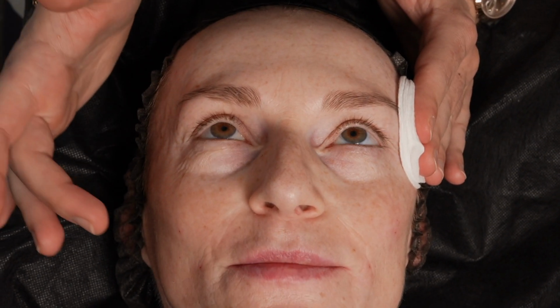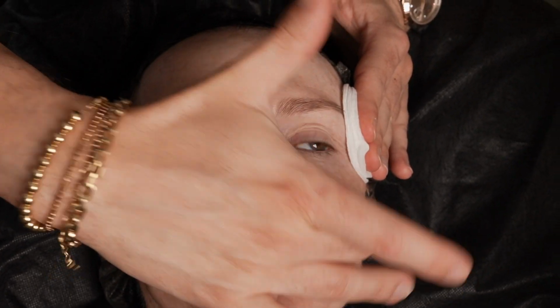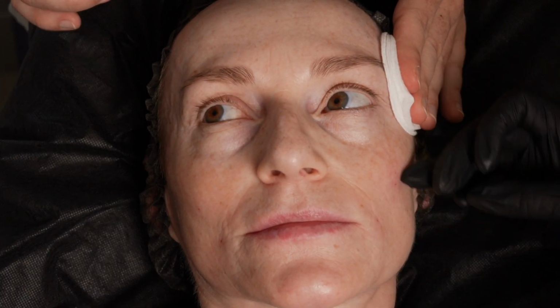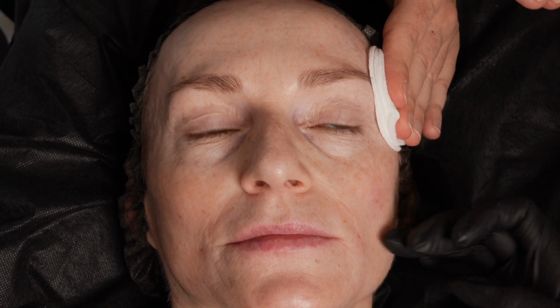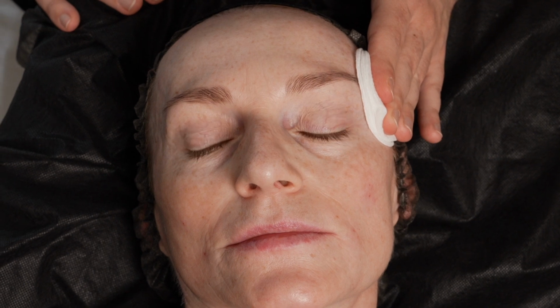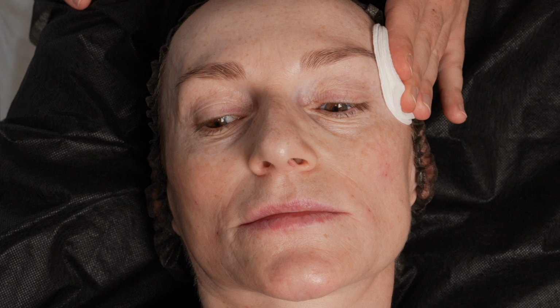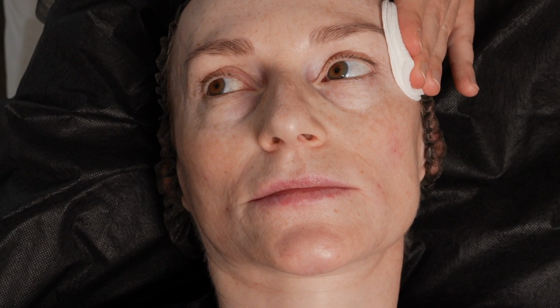She needs a little bit of volume here, this side. You see? Here more, here less. 4 or 3. Did you give here? No. Not yet. Okay, then do it later. She will do. Two. 1 syringe. Cannula, 25. 25.